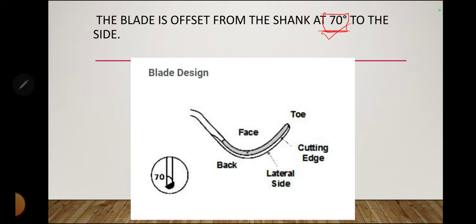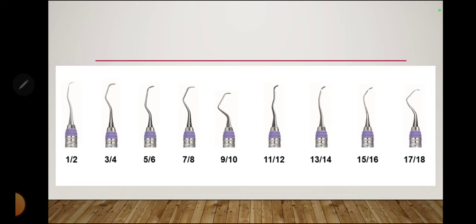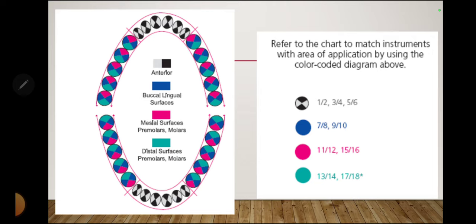Now, looking at the various Gracey curets, you can notice the difference in shank designs. The standard Gracey curets range from 1/2 to 17/18. Based on shank variations, the Gracey curets can be used on different tooth surfaces.